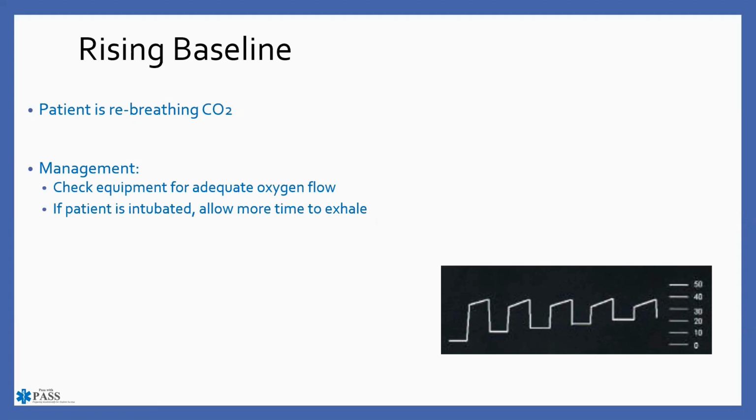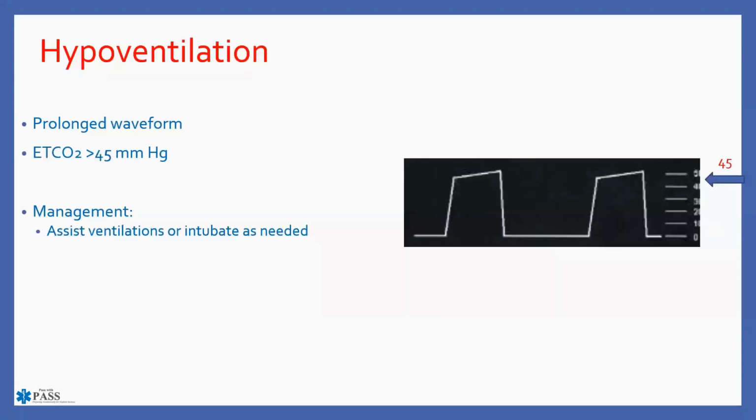And your I:E ratio is inhalation to exhalation. And there's some strategies there on how you best do that and whether or not they have ARDS and all kinds of situations that go into that decision making. But if you have the ability to do it, then you would want to extend your exhalation if you see a rising baseline.